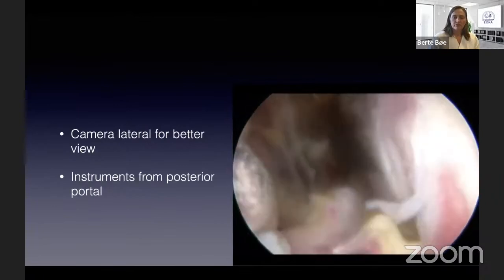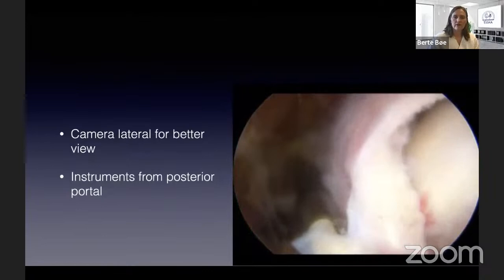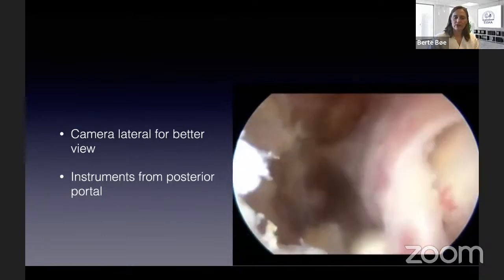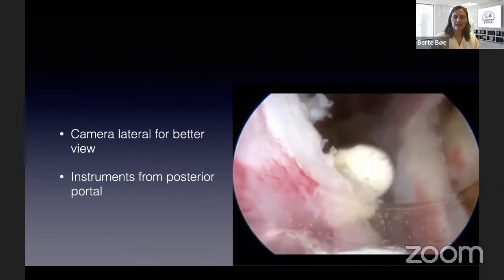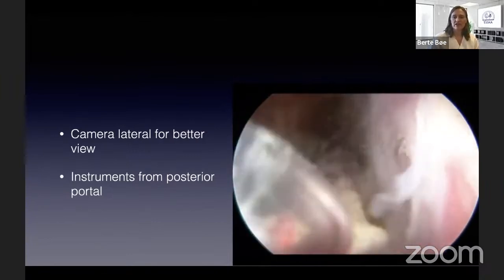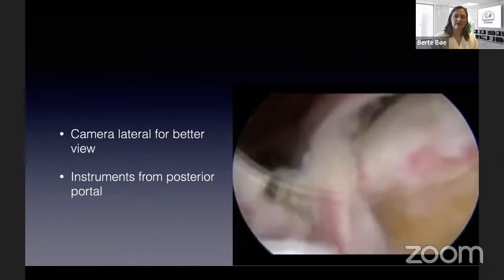But often I like to switch them, and here the camera is lateral looking into the defect, and the electrocautery probe is coming from the posterior portal. And in the beginning, this might be a little bit difficult because it turns everything upside down, but it's very useful for learning and it gives you another view of the defect.